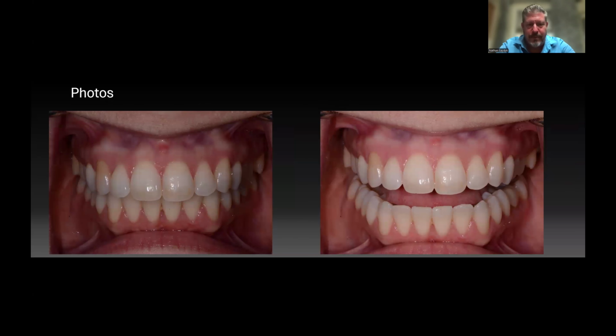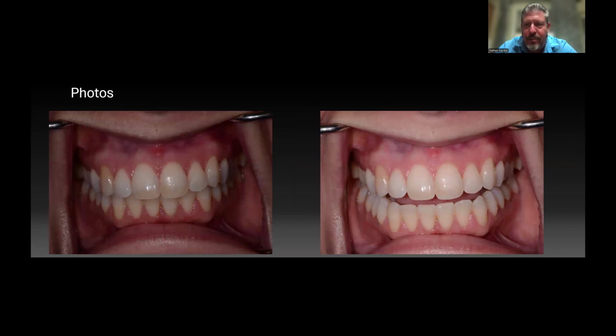Here's my wonderful example. You take this photo, we have teeth together and teeth apart so I can see the incisal edges, and you look at it and go, oh my gosh, she's damn near perfect, isn't she? Look at that. Incisal plane level, no canted maxillary midline, looks fantastic. Here's the problem. That's not her. When they looked through the viewfinder, they lined up the little X so that they could see the lower teeth, and they put the little thing right over here and they took that photo. It looks fantastic. But when you look at her face and relate her teeth to her face, this is her.